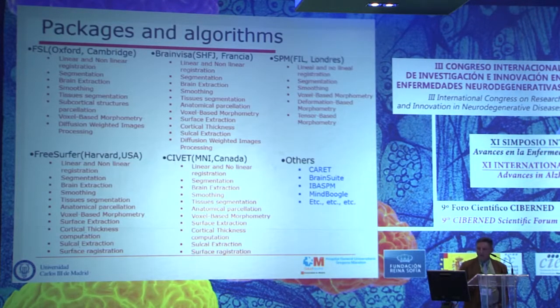Actually, the number of procedures I can apply is definitely huge. Many of those algorithms are grouped into packages, and most of those packages are free and can be freely downloaded from the internet. In many cases, they include similar steps, for instance registration, segmentation, smoothing, but unfortunately, almost never are the results from similar algorithms taken from different packages the same. So you obtain different results depending on the package you use.